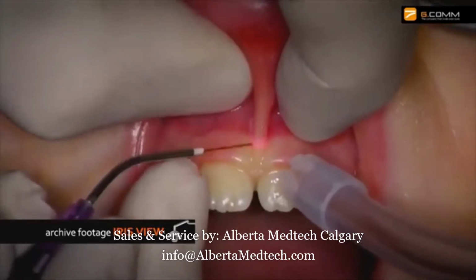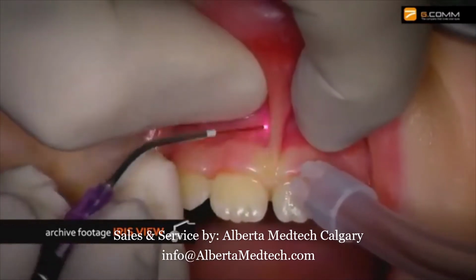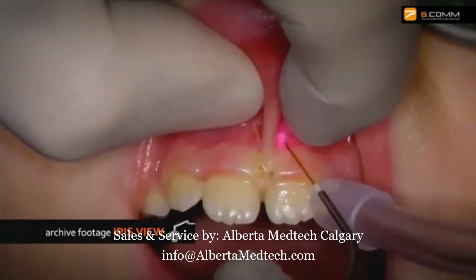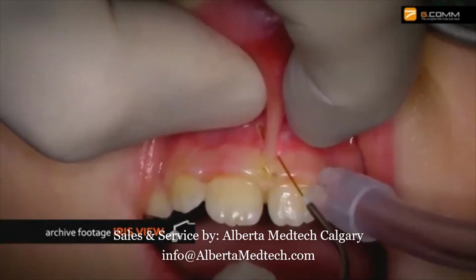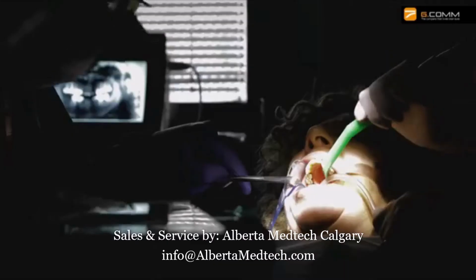A white that mustn't be too brilliant. A mucous membrane, whether it be gingival, cheek, tongue or palate, that isn't too red. However, in these cases, above all with LED lamps, we can modulate this intensity, and this is a fundamental aspect.